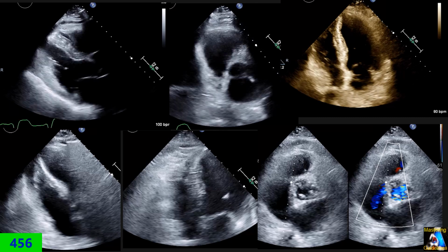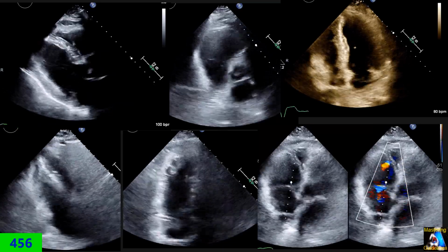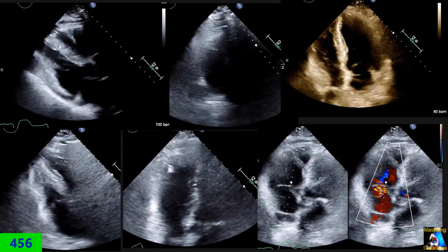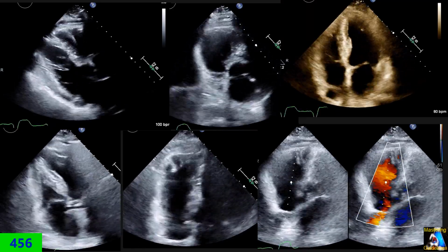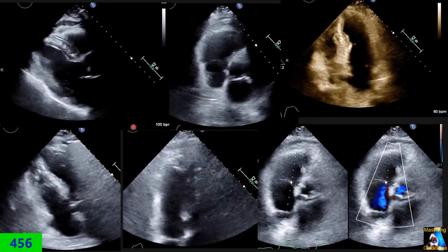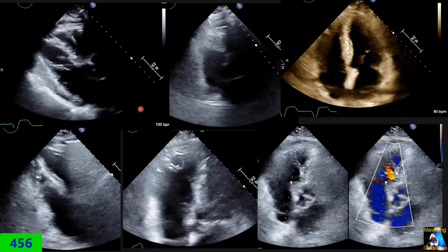A transvenous temporary pacemaker is almost universal post-TAVR. In almost most centers they put in a temporary pacemaker, or for any bradycardia the patient had during the OR. Usually, a temporary transvenous pacemaker is the choice. This pacemaker has one lead, and there are different types of tips for the temporary pacemaker. Some of them are blunt and round. Some of them are a little pinpoint, and the thickness of the tip is about 1 to 2 millimeters.